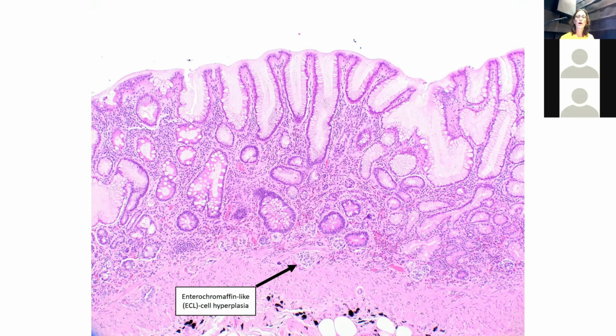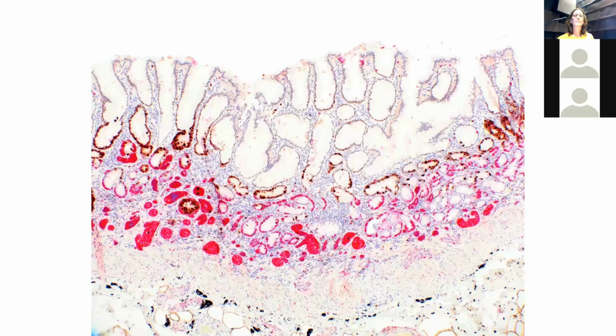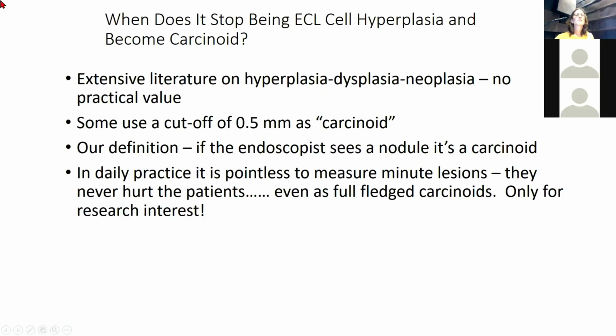And I've indicated a pocket of it in this image. Remember, this is gastric body, so you can see all the intestinal metaplasia. This is that same peculiar preparation, just showing you that Ki67 highlights the proliferation zone. And then you can see that these nodules are neuroendocrine type things. So there's a, oh, wow. So it's missing, I don't know how to move this.